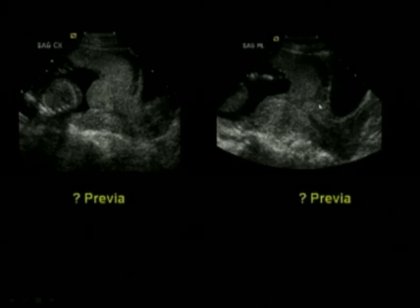Everything is distorted. So what do you have to do? Well, don't even try to determine whether there's a previa on these pictures. Don't spend any time. You just can't tell. What you have to do when this happens is wait a few minutes for the contraction to go away, and then when the contraction goes away, you'll be able to tell whether it's a previa or not.